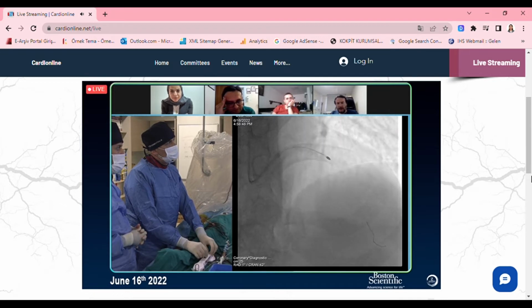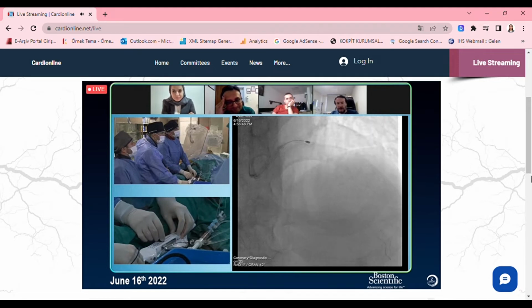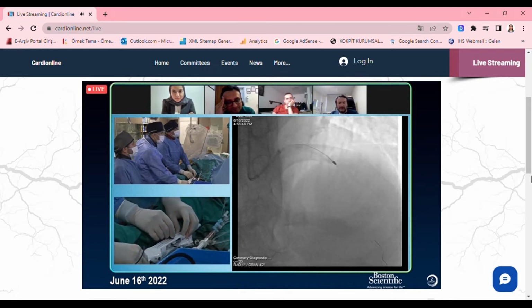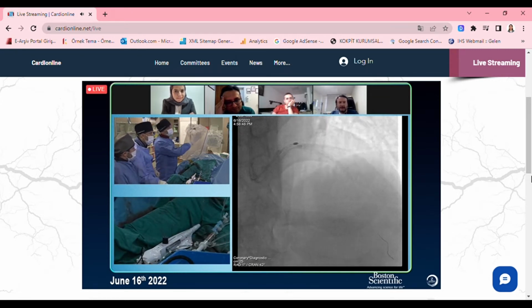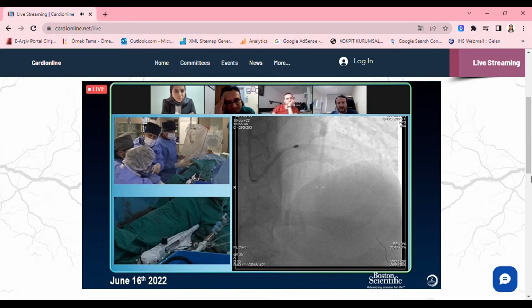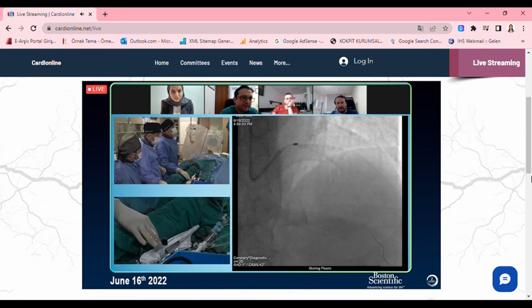This is nice. Definitely a change from the first one. Another run. The important thing is that we have to park our burr at the end of the rail, not the middle or the other side. You have to come back to the end of the rail.